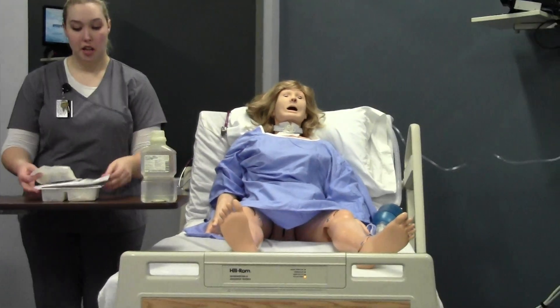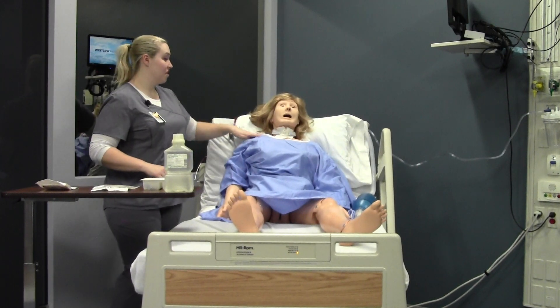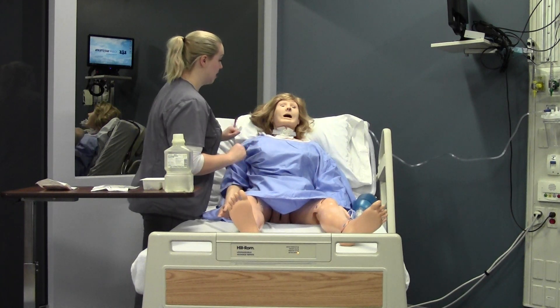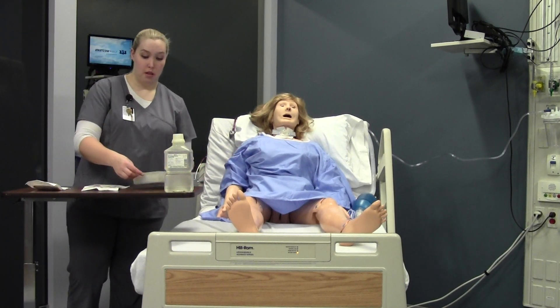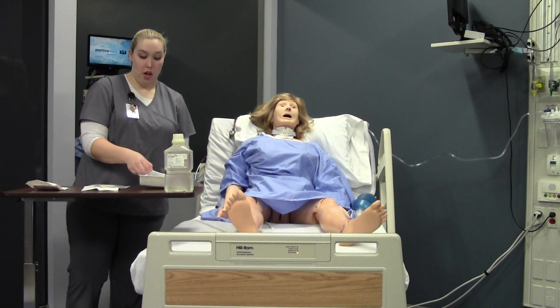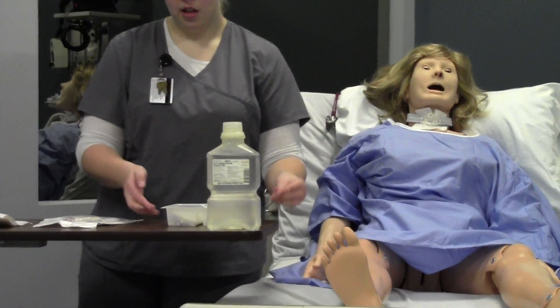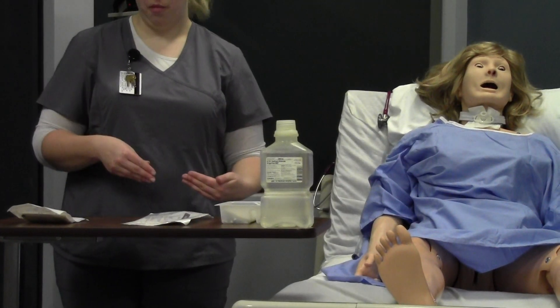I've got my sterile saline, my suction, my tray, and my gloves. I'm going to go ahead and get everything ready. This is a clean-to-sterile procedure, so wash my hands and get my gloves on. I'm going to open my tray — the suction tray — away from me and throw away the wrapper. Remember you have your one-inch borders, so I can touch along this side. I like to make sure I have my packages opened in the way that I'm going to use them, so I may rearrange them shortly after I open all my packages.